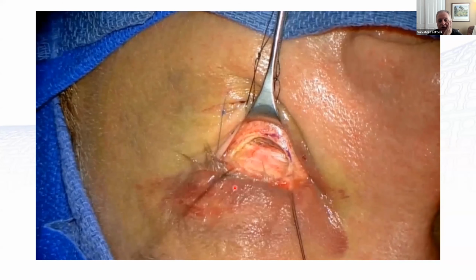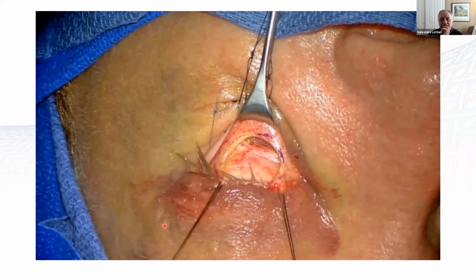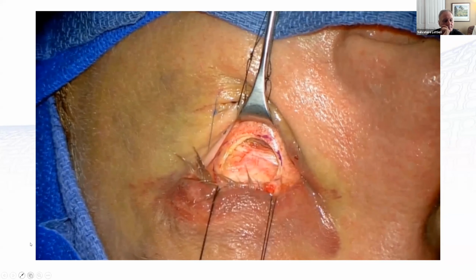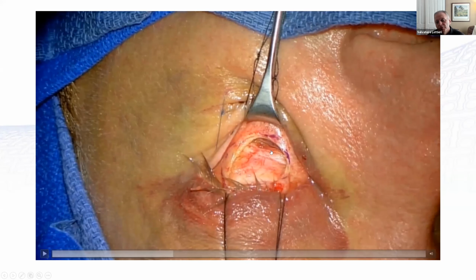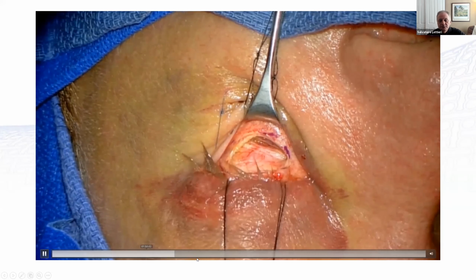This is now my corneal protector. I put in a couple more sutures here that help reflect the conjunctiva. If you look here at the muscles, you can actually see these are the lower eyelid retractors that have been transected. We'll reflect those, and then we'll replace the Desmarres, holding everything superiorly. And once we've done this, it's actually a straight shot to get down to the floor.